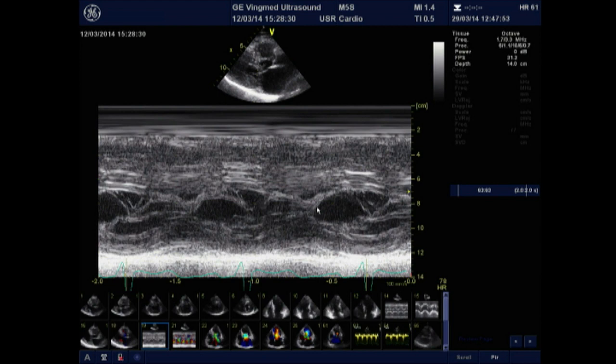which touches and has contact with the interventricular septum. You can see we are in systole, and it touches the septum in mid-systole, and the contact with the septum is long until telesystole, until the end of systole. This also points to intraventricular obstruction.